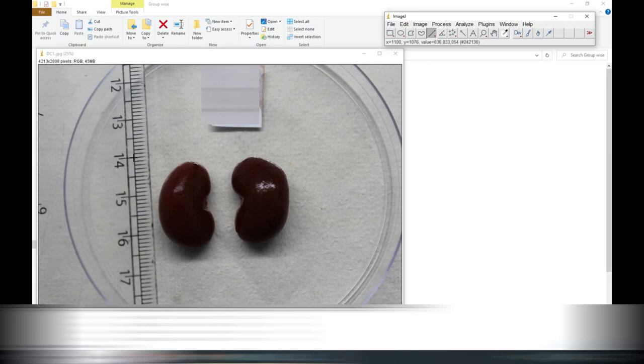For every image you need to put some measuring tool. While you are taking a new image, you have to set a global measurement because every image has its unique pixel.